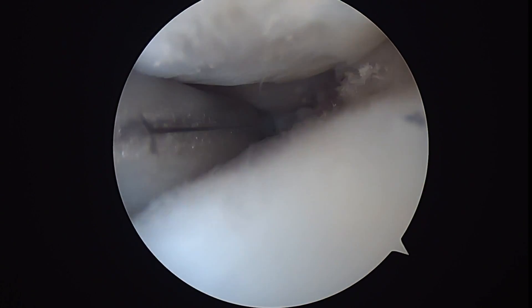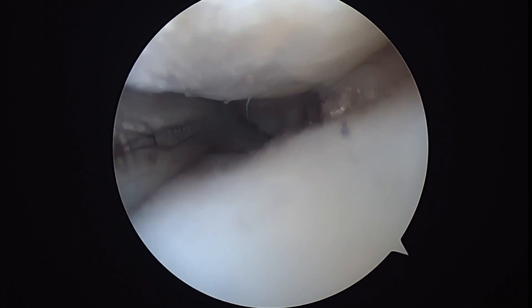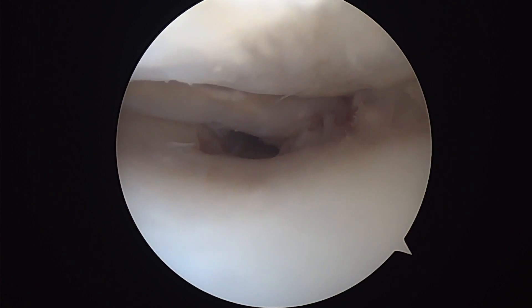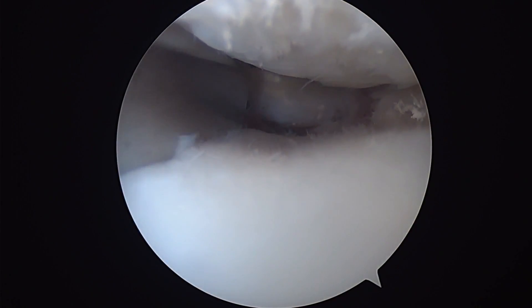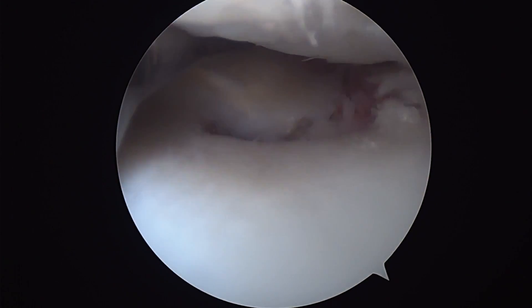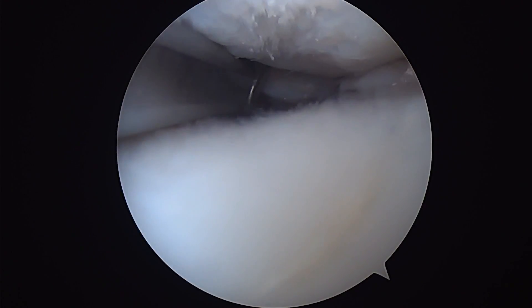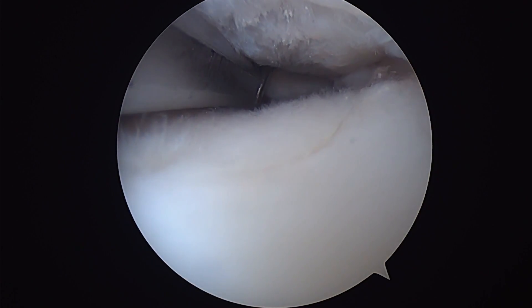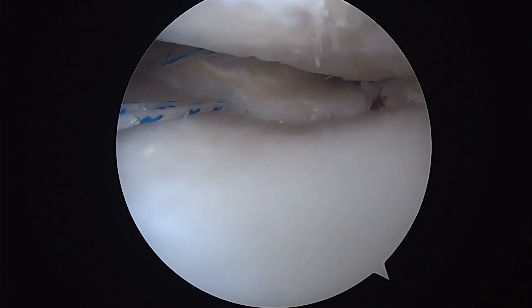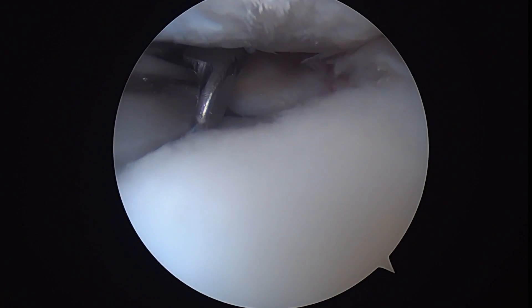A curette is used to debride the overlying articular cartilage in the area of the anticipated repair. Those articular cartilage fragments are then removed and the repair site is inspected to make sure it has been completely prepared. The terminal end of the meniscus is verified to be reducible at the repair site. A suture passing device is then utilized to pass a purse-string suture just medial to the terminal end of the medial meniscus, and here we see the suture being passed and retrieved.